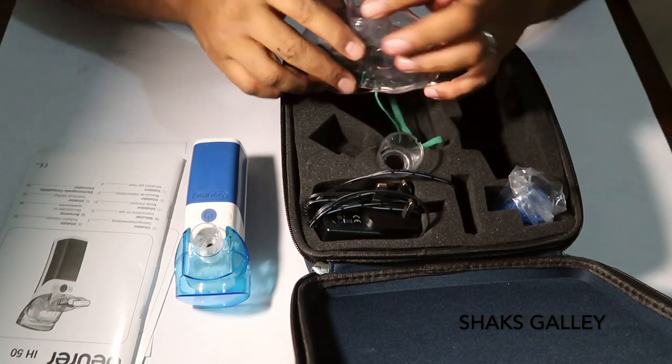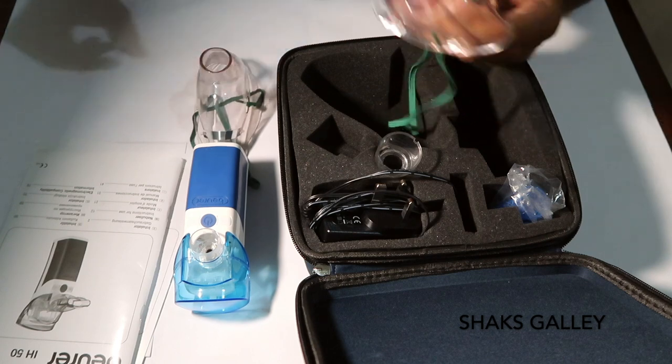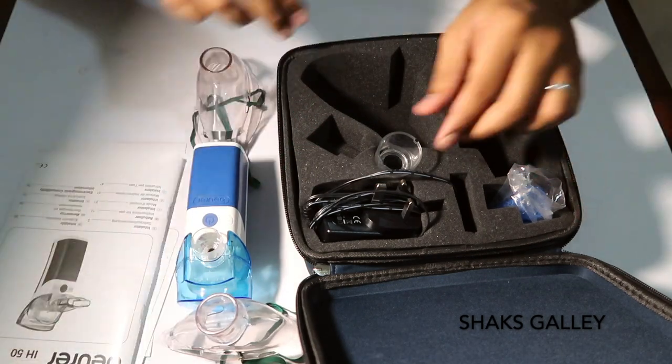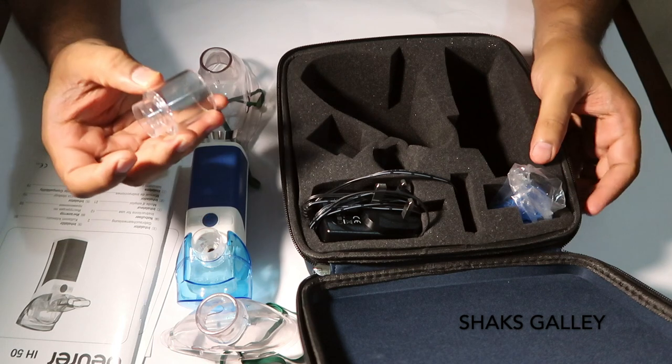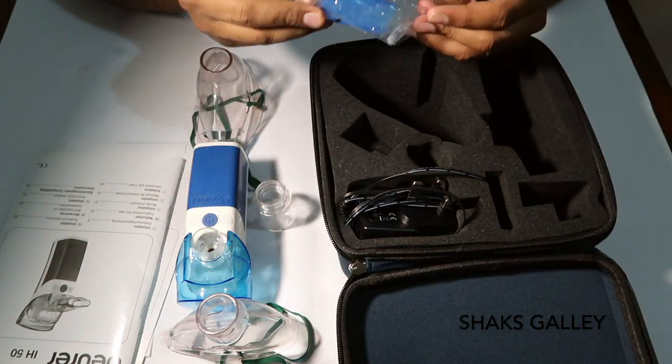This is an adult mask. This is a child mask. These are the masks included with the device.